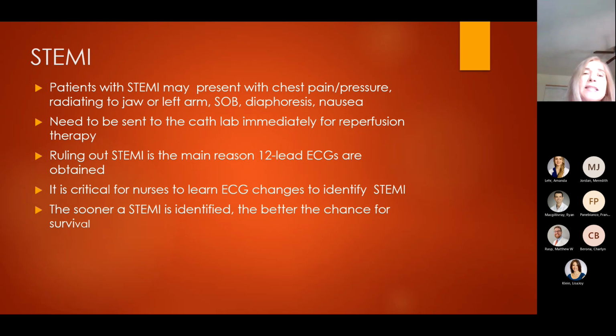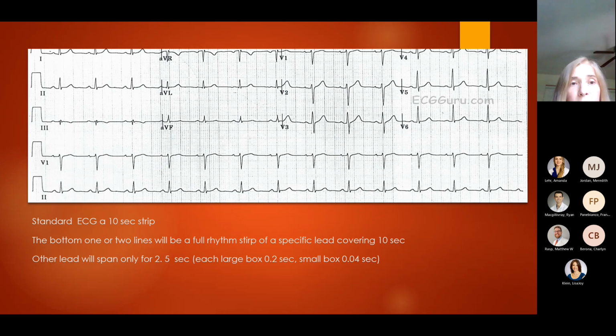Ruling out STEMI is the main reason why we do a 12-lead ECG. So it's critical for nurses to learn ECG changes to identify STEMI prior to getting the provider. Basically, the sooner STEMI is identified, the better the chance for survival.